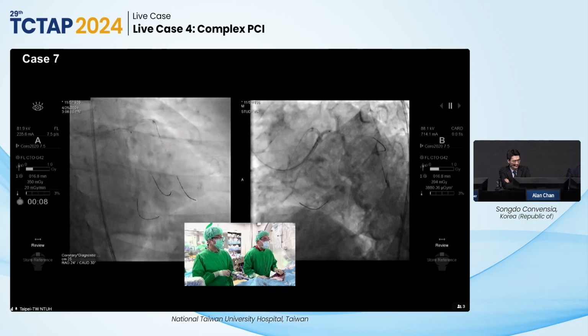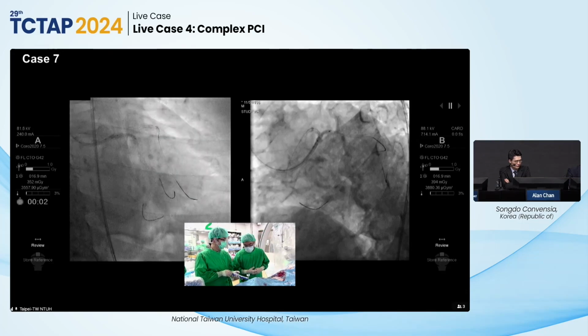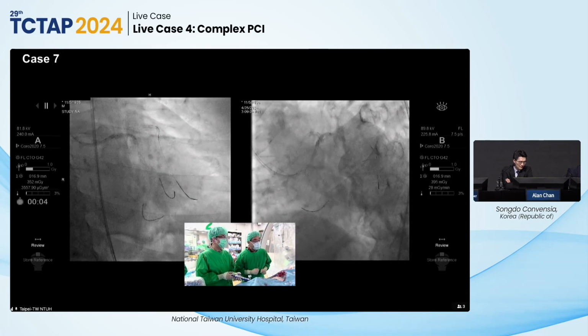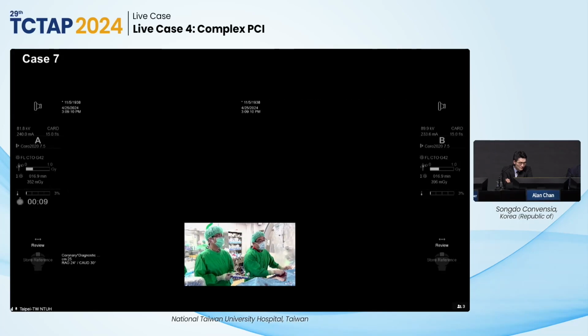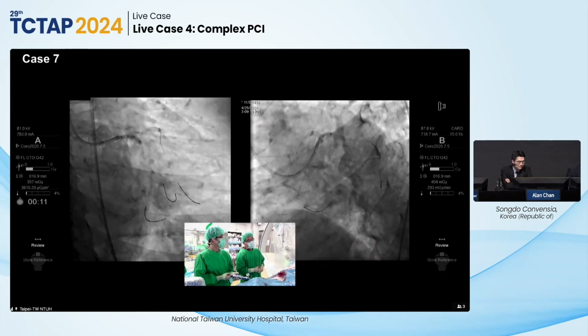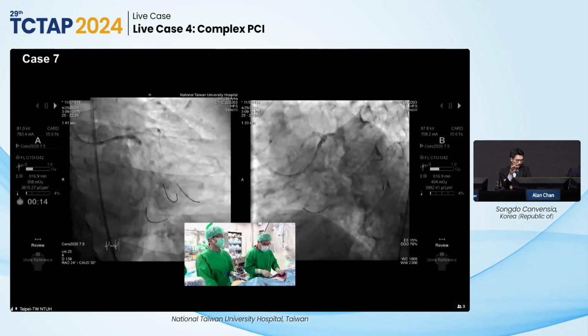It's a 3.25, right? It's a 3.5. Yeah, it's still there, there's a waist over there. 16, 16. 20. Okay, now it's 20. Yeah, I agree. From the spider view, there still seems to be a waist in the circumflex.